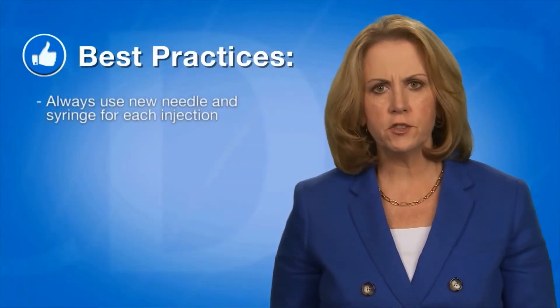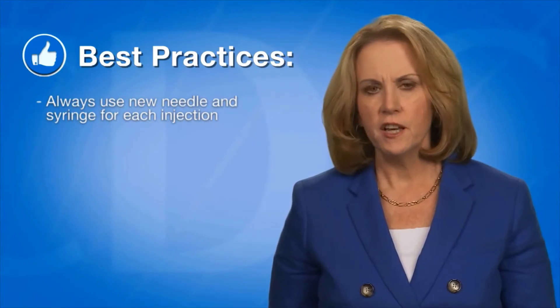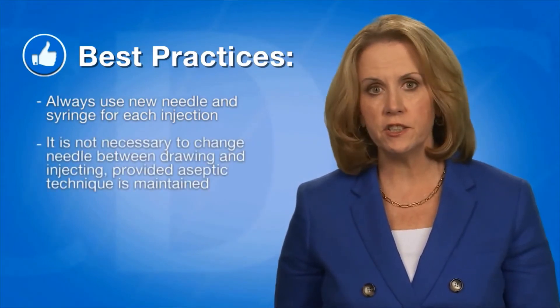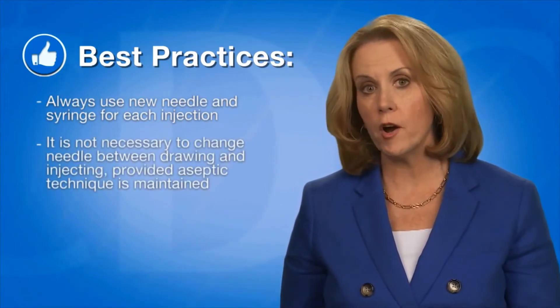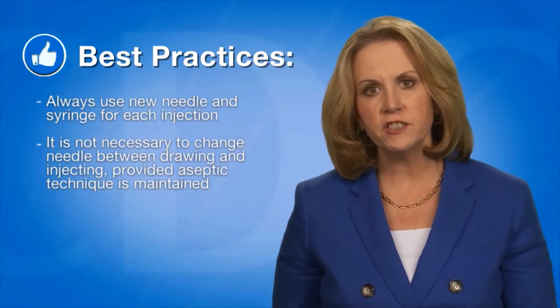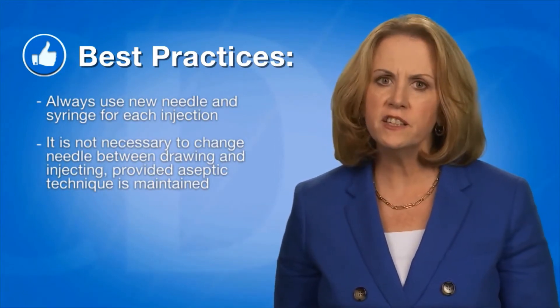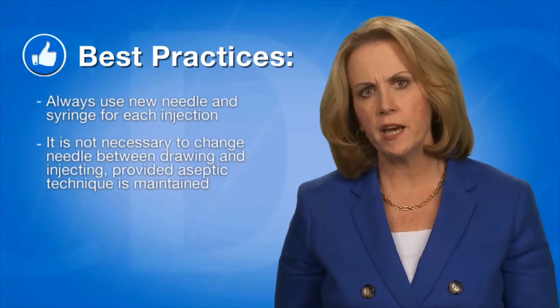Always use a new needle and syringe for each injection. It is not necessary to change needles between preparing and drawing vaccine from a vial and injecting it into the patient, unless the needle has been damaged or contaminated.